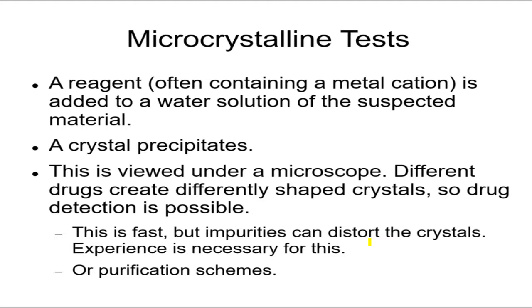And what they can do also is use a purification scheme that will remove the impurities from the drug, however the purification scheme works. Then when you do the crystallization with a special reagent, you'll see what the shape is, and therefore what the drug is.